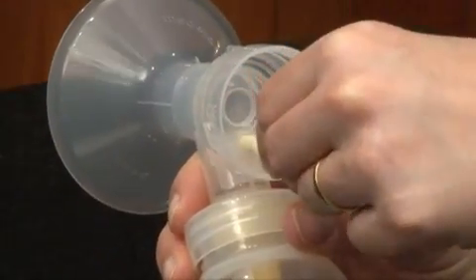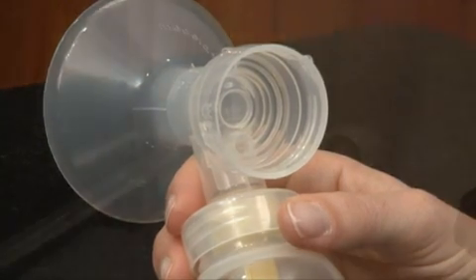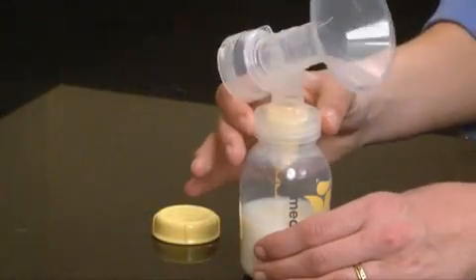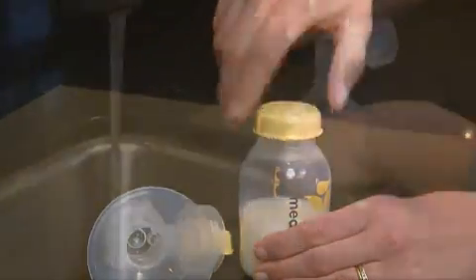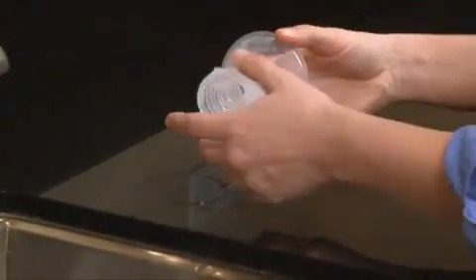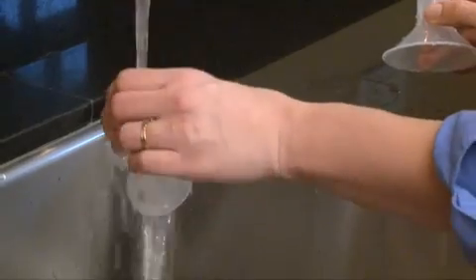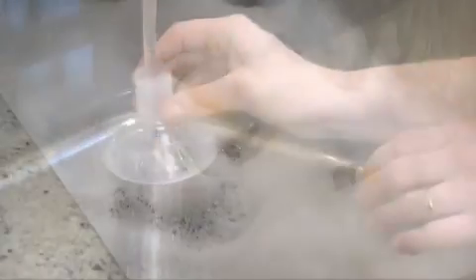Once you are finished pumping, unplug the tubing from the back of the breast shield before removing the bottles from the connectors. Allowing the pump to continue to run with only the tubing attached for 1 to 2 minutes will allow any condensation that may have formed in the tubing to dry. After each pump session, disassemble, separate, and rinse all parts that come in contact with breast milk in cool water to remove breast milk residue.